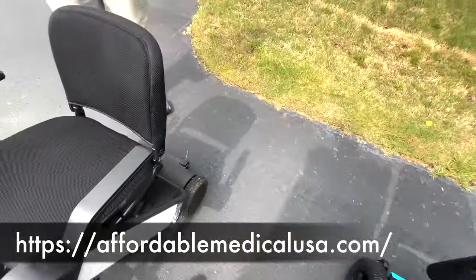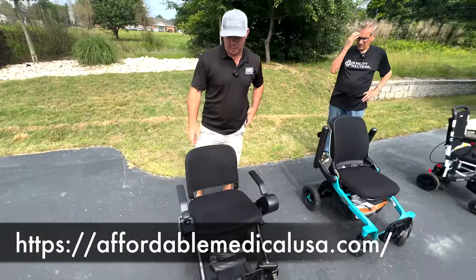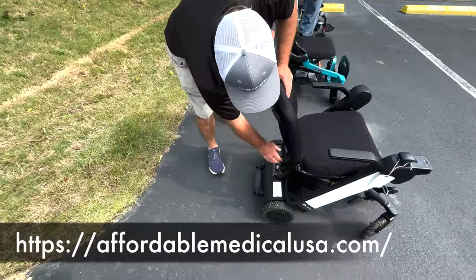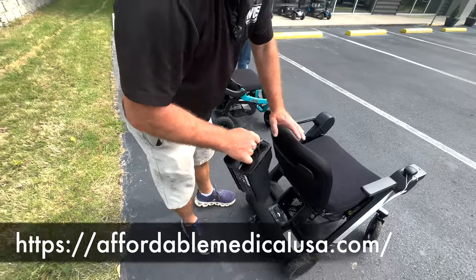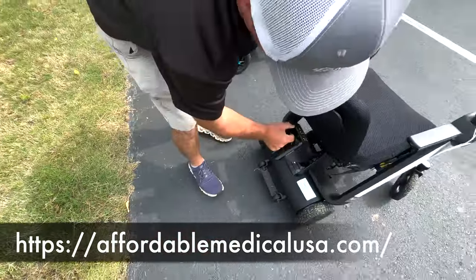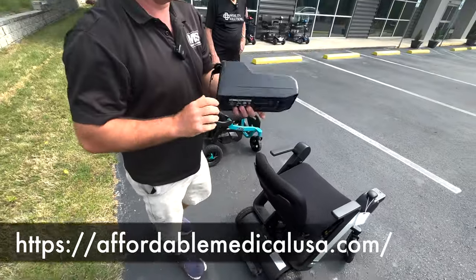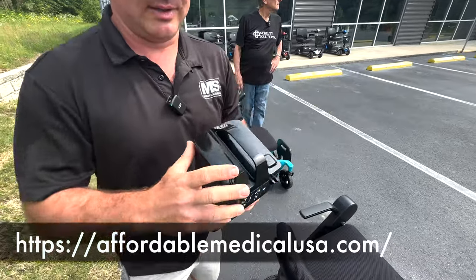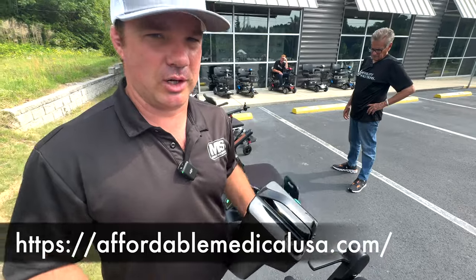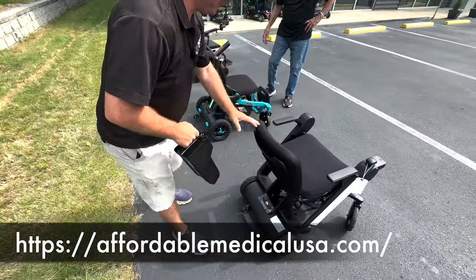How you can charge this unit is different than all three of these. You have one way of charging it unless you buy an accessory port that you can bring up here. I don't know really how that would work on this particular unit. But this is the battery. You can charge it right through here. You can keep this in to charge it. And again, this is lightweight, about 6 pounds, FAA approved. You can travel all over the world with this thing. You don't need an extra battery unless you think you might need one because you're using it all day, 8 hours or something. So that's the battery.